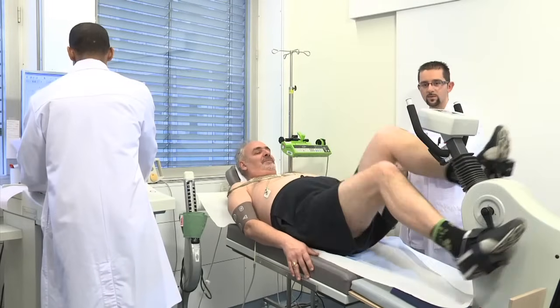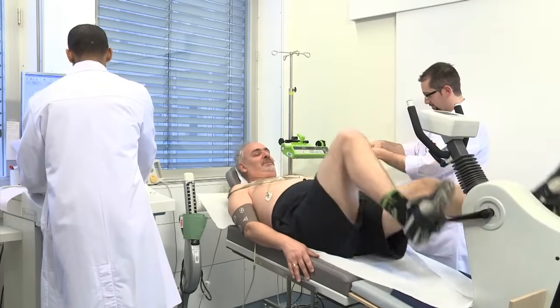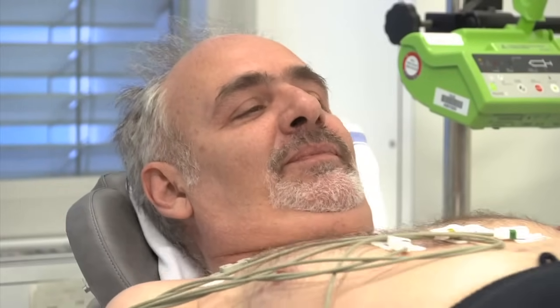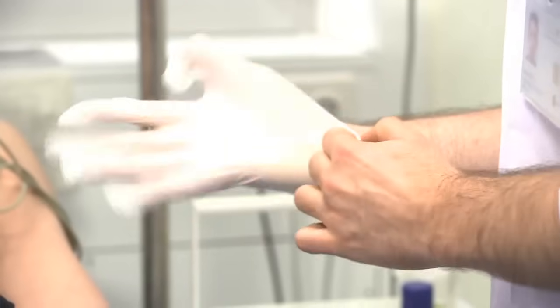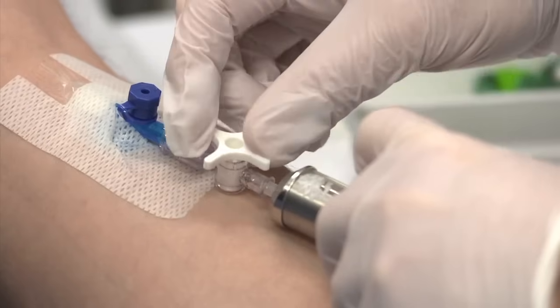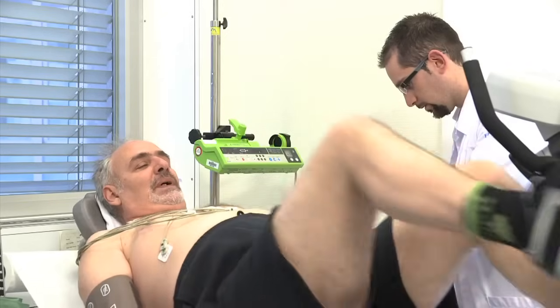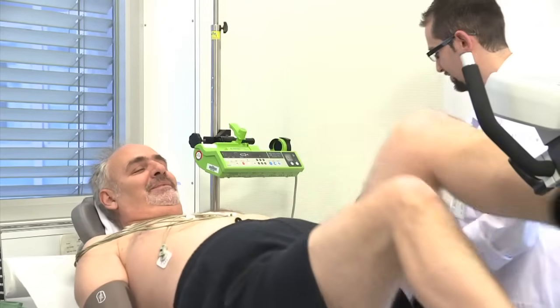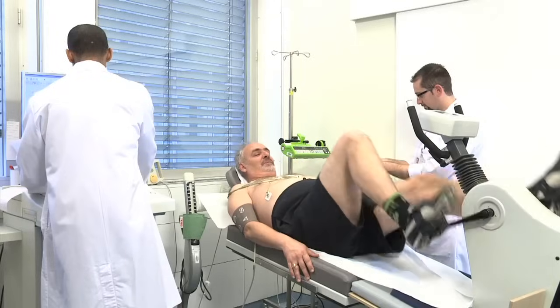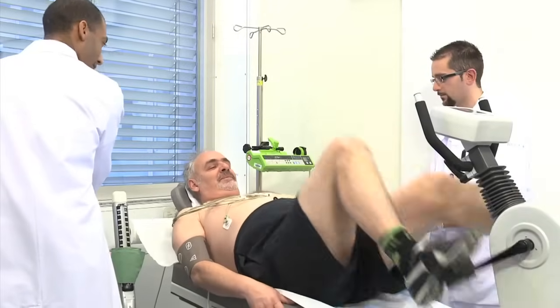Les images sont réalisées environ 30 minutes après cette préparation. Maintenant, votre cœur bat à sa fréquence presque maximale. On va vous injecter le traceur. Durant le test d'effort, une faible dose d'un produit radioactif, le traceur, est injecté par la voie veineuse. Le produit injecté circule dans le sang et va se fixer dans le cœur, permettant ainsi de mettre en évidence l'alimentation du cœur en nutriments et en oxygène.